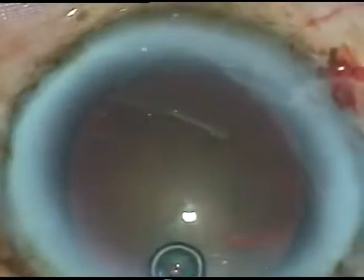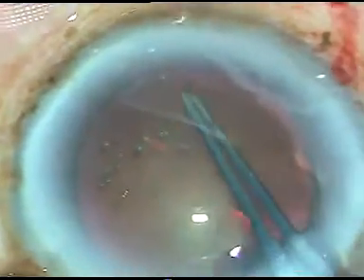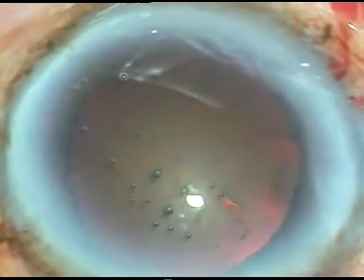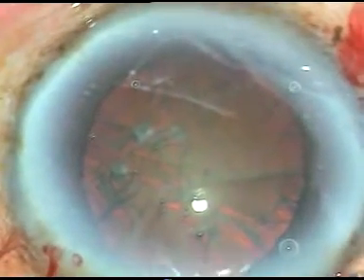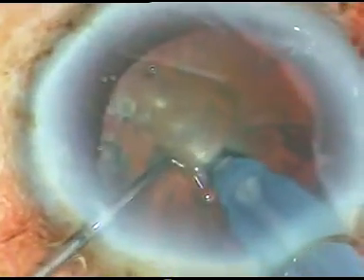By this time all the incisions have been made. Now capsulorhexis is being done with the help of a utrata forceps. This cataract appears quite hard, it is about grade 4. The machine being used in this case is the Oertli Cataract 3 phaco machine. The vacuum was 500 millimeters of mercury and the flow rate was 50 ml per minute. Phaco power is 80%, in phaco 2 mode, and at this moment I am doing a direct chop.